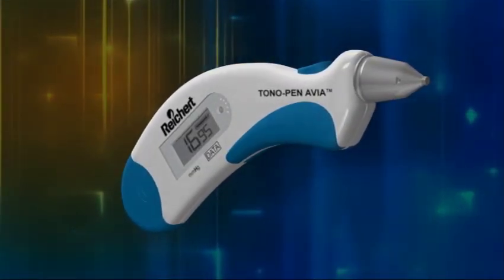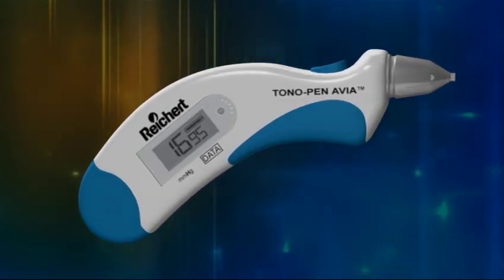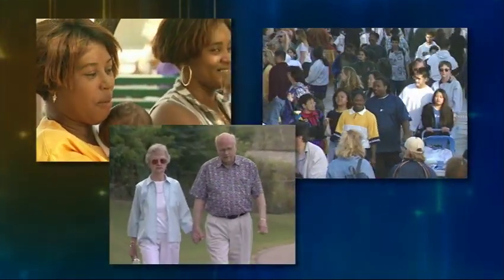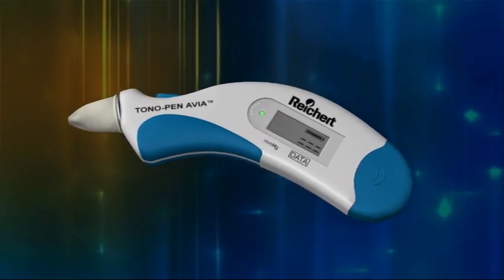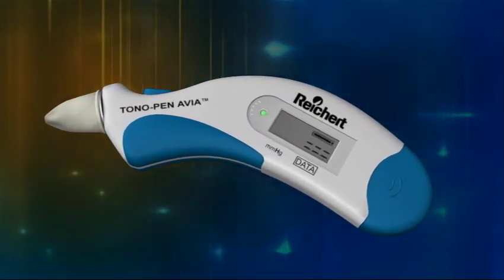The Reichert Tonopen Avia Handheld Tonometer is the next generation in the Tonopen family of Applanation Tonometers. A wide range of patients are considered to be at risk for glaucoma and may need routine screening. The Reichert Tonopen Avia Tonometer offers the medical community a simple and accurate option for patient screening.